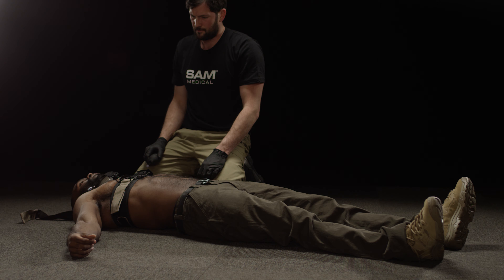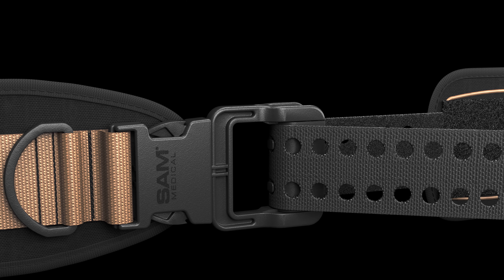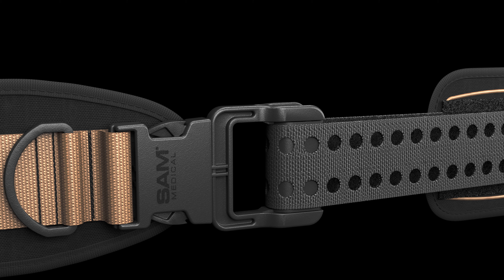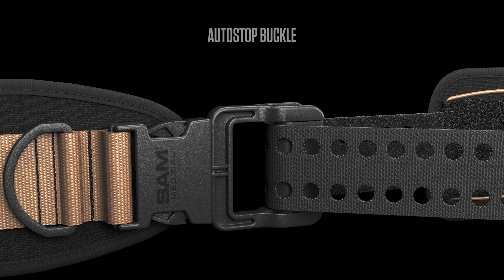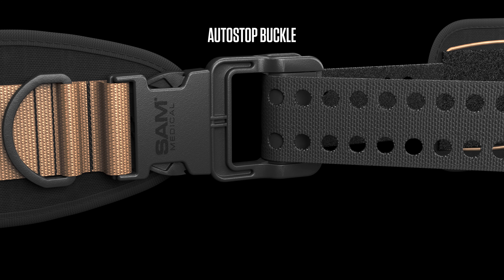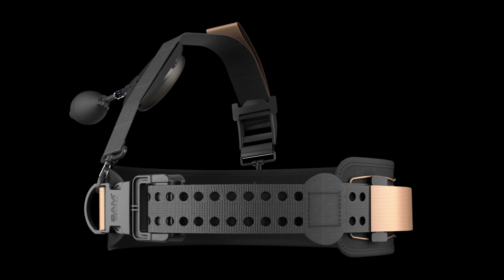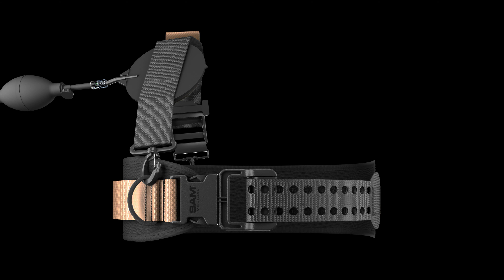Remove only at a definitive care facility. Unlike the locking TruForce buckle found on the new Sam XT extremity tourniquet, the Sam AutoStop buckle does not lock, allowing you to quickly reposition the SJT for proper alignment if necessary. Learn more about the Sam Junctional Tourniquet at SamMedical.com.